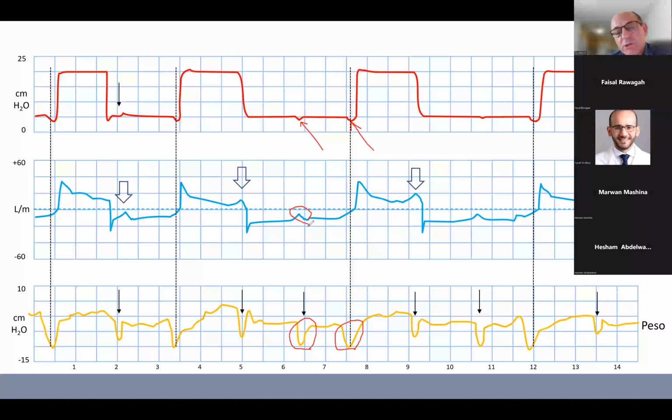It's not double trigger. We're going to be talking about double trigger because he already finished the breath, and this is another breath. So this breath is happening when there's still persistent flow. Take a look here. Okay. So if there's persistent flow, there's a pressure. So the alveolar pressure, actually you don't see it here. The alveolar pressure is going to go down like that. So this is what he needs to overcome. Okay. So this pressure is dynamic. It's going to go down gradually.